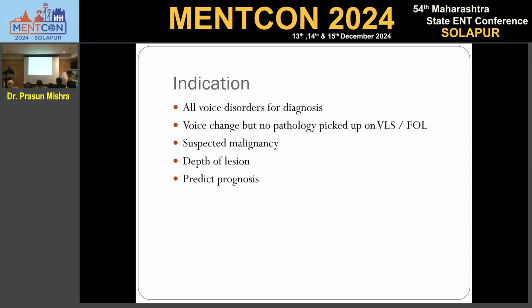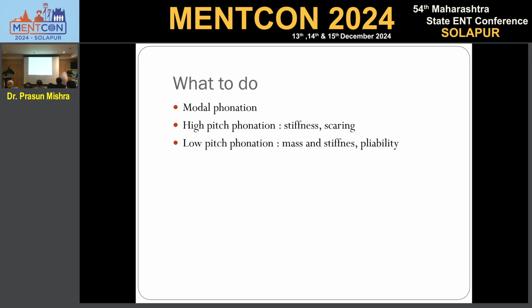Vocal cord movement we all see, but the vocal cord, as I said, is in closed phase that we are assessing. So the pliability of the cords is very, very important that we assess when we are doing a strobe. And yes, one important point.